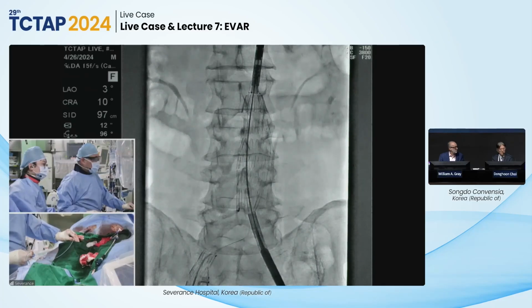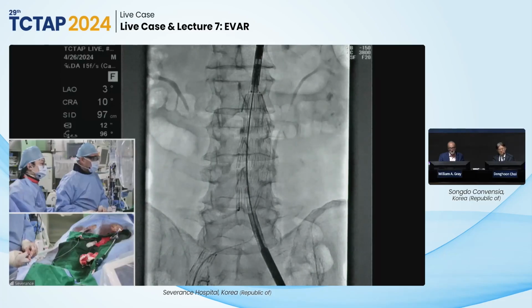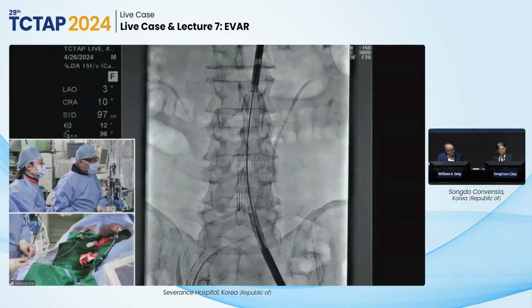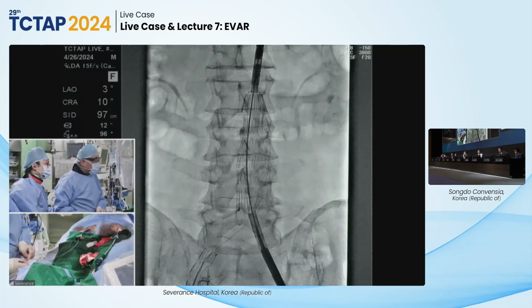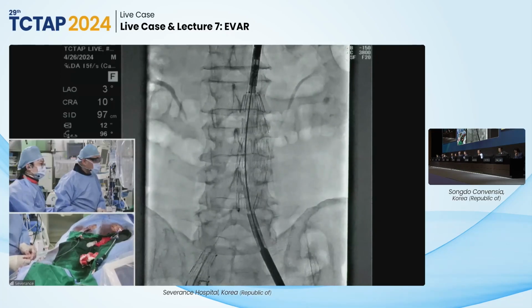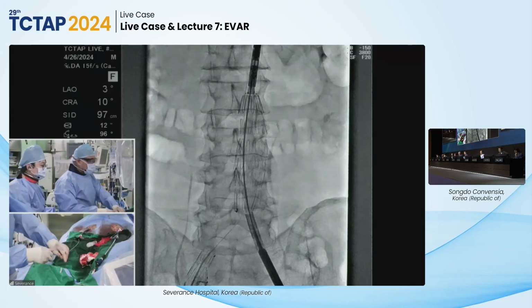Doctor, you did not open the main body. Not yet. Yeah. So it makes it more stable. Dr. Ko, I'm Sang-Soo Lee from Busan National University Yangsan Hospital. Yes. Why do you open the top cap? First of all, I think it's a fixation for the proximal leg. So you mean deploy the proximal part first? Yes, first, because there may be a little movement in the proximal leg. Yeah, okay. Let's do it.